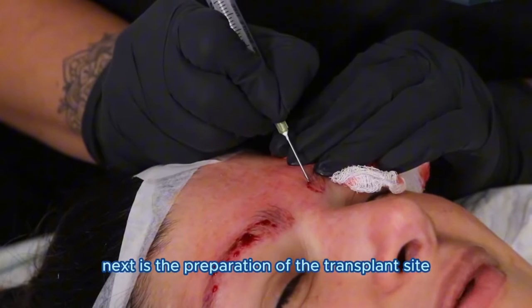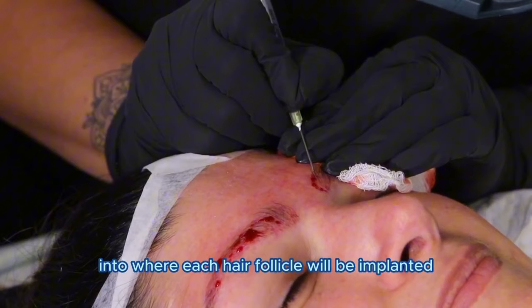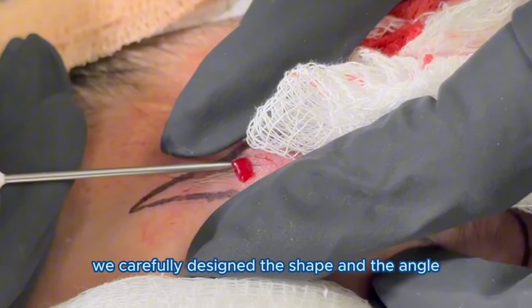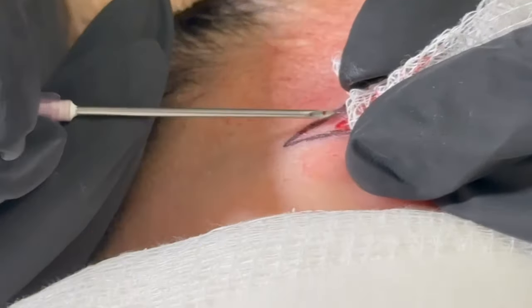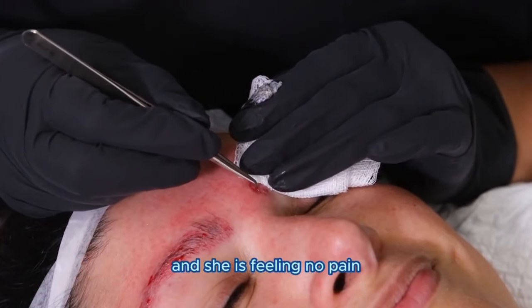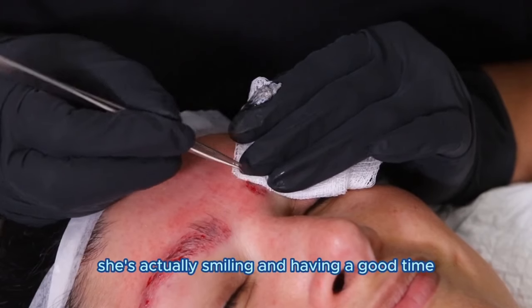Next is the preparation of the transplant site. Here you can see us making little incisions into where each hair follicle will be implanted. We carefully designed the shape and the angle of the eyebrow to ensure a natural looking result. This patient is wide awake and under local anesthesia, which means anesthetics were injected into her eyebrows and she is feeling no pain. As you can see in some of the clips, she's actually smiling and having a good time.